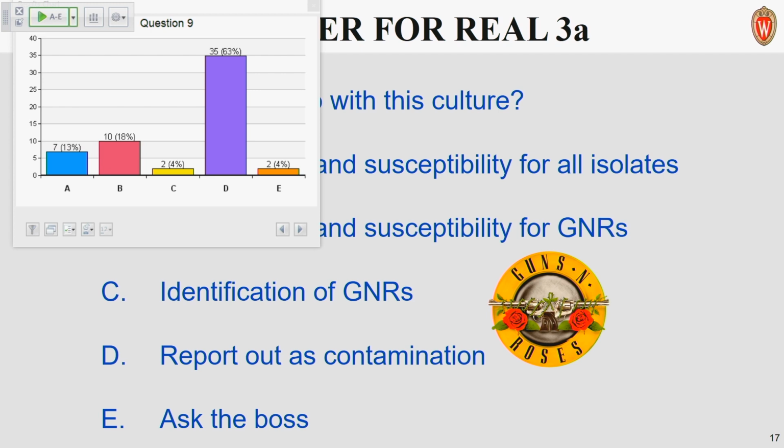Just a show of hands, how many of you set up a CNA on your urine cultures? We do not. If you have your hand up, could you tell us a benefit? What is the helpfulness of that CNA? So it depends. We only set up CNAs on indwelling catheters and straight caths. On clean catches, we only do blood and MacConkey.